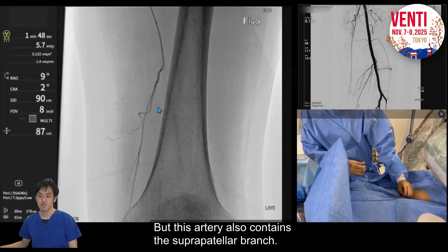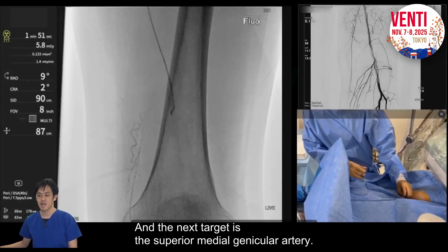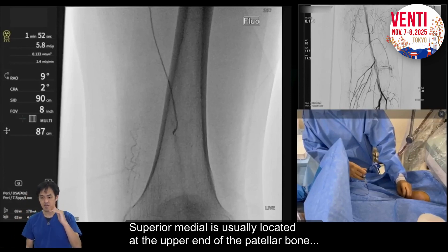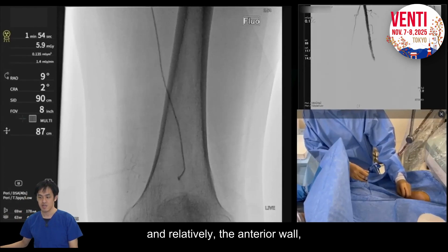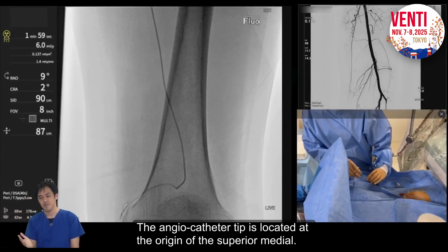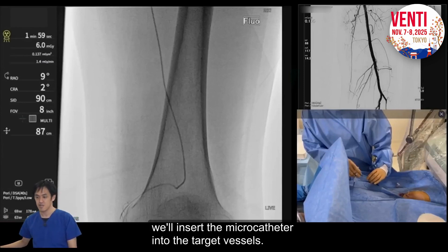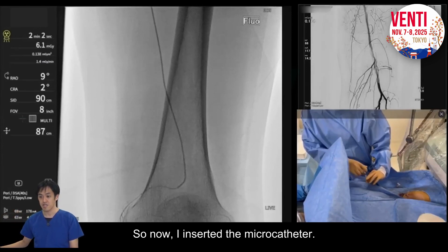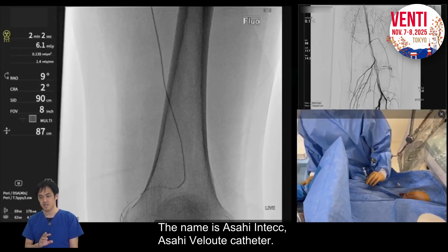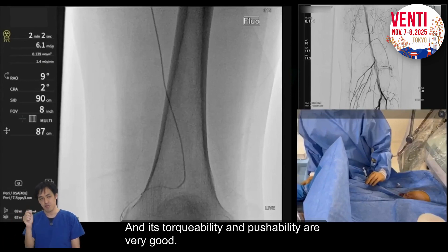This artery also contains the suprapatellar branch, but this patient does not have suprapatellar pain, so we will skip this artery. The next target is the superior medial genicular artery, usually located at the upper end of the patellar bone. The angiocatheter tip is located at the origin of the superior medial, and from here we insert the micro catheter into the target vessels. We use a 1.7 micro catheter, Asahi Intec Asahi Bellute catheter. It's very useful — having a small angle, we can choose small branches, and torqueability and pushability are very good.